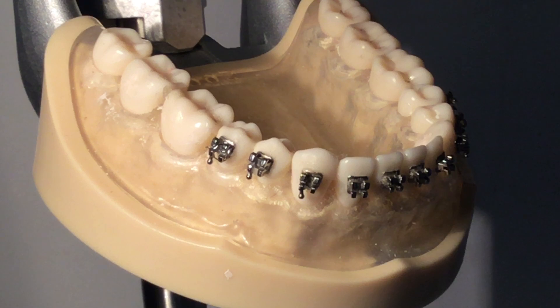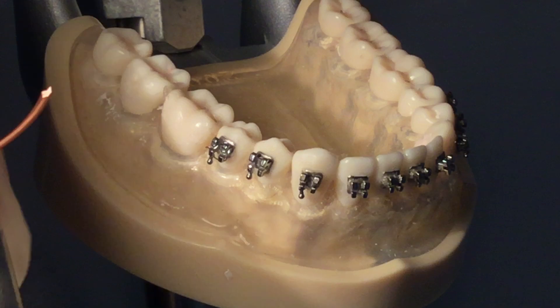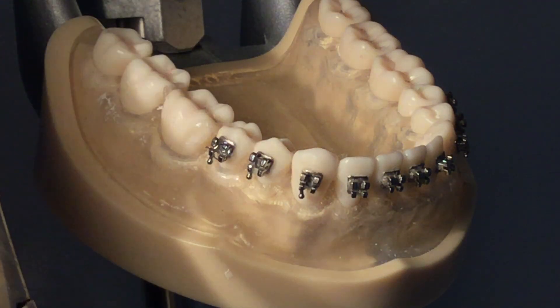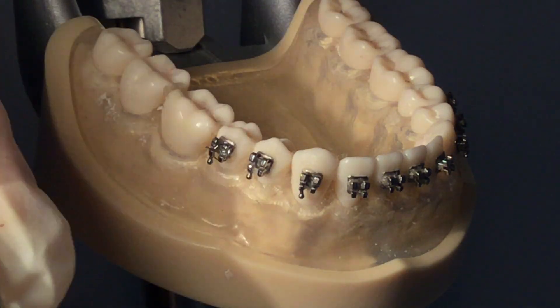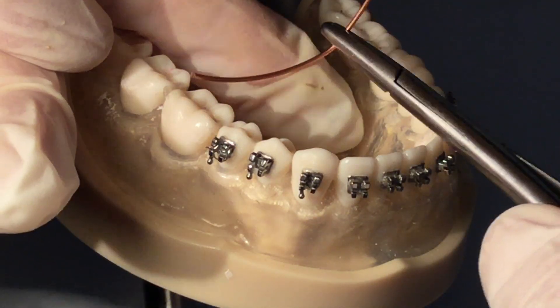Using interlocking hemostats, thread the brass wire from the lingual aspect under the contact through to the buccal side over the occlusal surface.